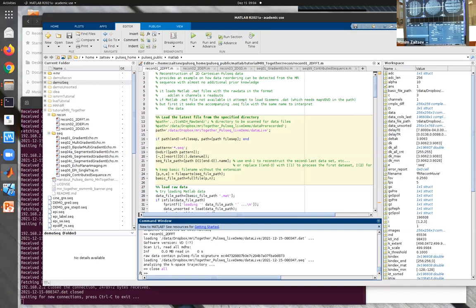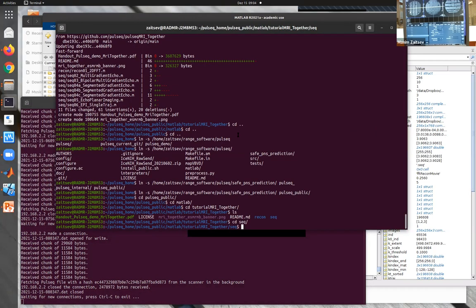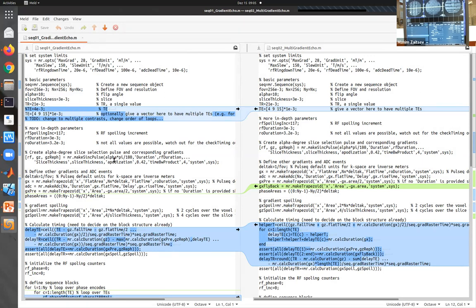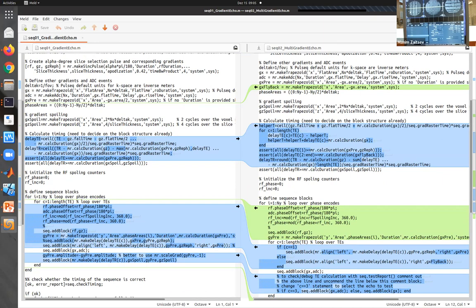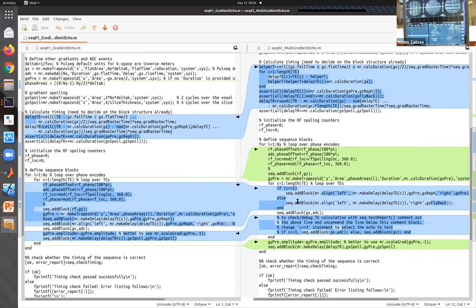So now what I was thinking about while preparing this is to show you how easy it is to create other sequences. If we would like now to convert this sequence, which is sequence 01, to the multi gradient echo sequence with a single train of echoes, it's just a few lines of change. We will do something with high level parameters. We calculate new flyback gradients, which bring us back. And the timing calculation gets a tiny bit more tedious, but it's fairly trivial. And with that, you can define your new sequence.